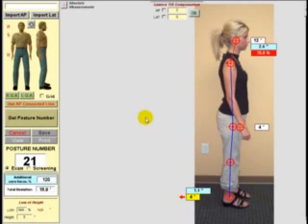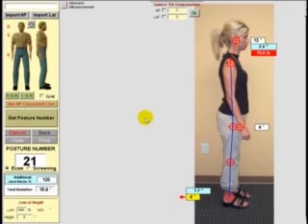The next thing you'll notice are the crosshairs that have been left on the picture. You'll notice how easy it is to see where the offsets are based on these new crosshairs. The lines are connected right to the center dot of the crosshair. As you explain to the patient that all of these crosshairs should be on top of each other in a straight line, it's easy for the patient to understand where the offsets are and how much they are. These marks will also appear on the printed reports.